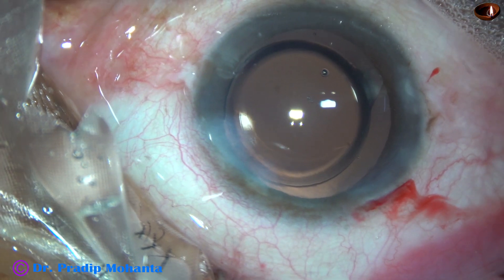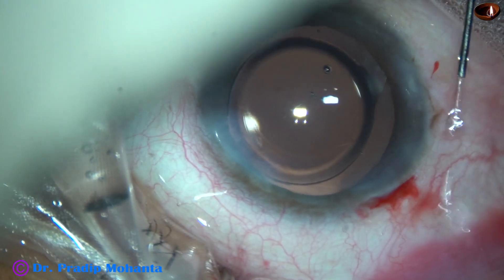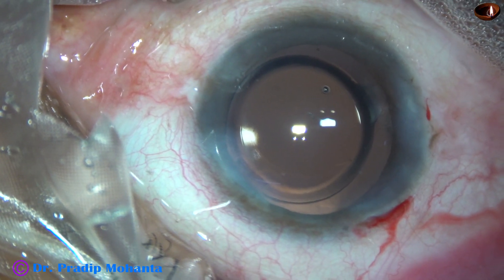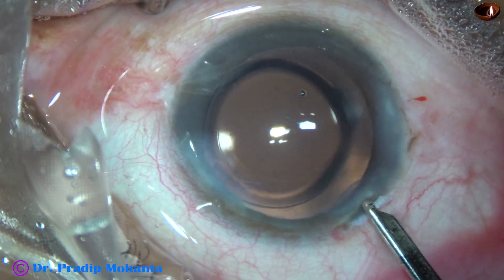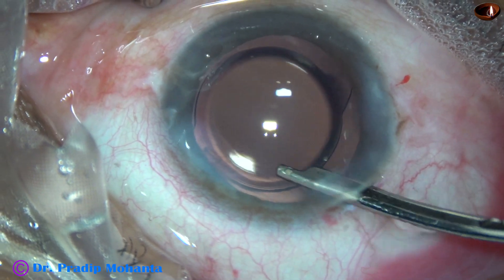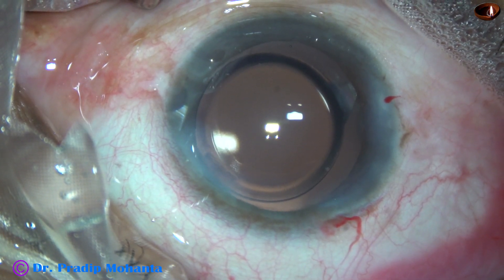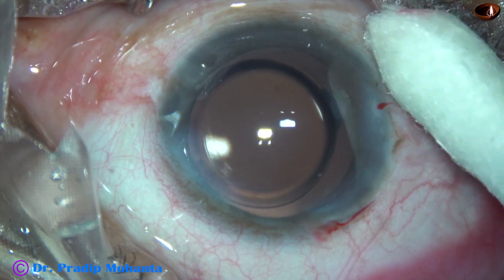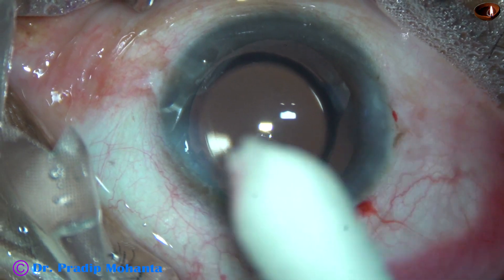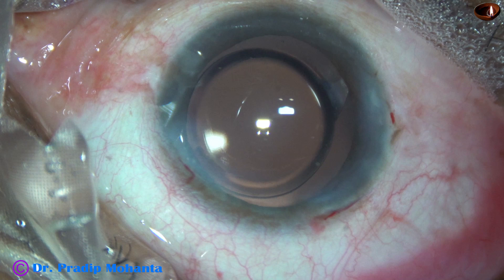Now the side ports are closed by hydrating the corneal stroma. We should always hydrate the posterior part of these incisions. The main wound doesn't require any hydration — we have not touched the main wound at any point, so it will seal automatically. There is no leakage from the main wound. There is a little bit of ooze from the left side port — keep it pressed for a few seconds and the ooze of BSS stops.